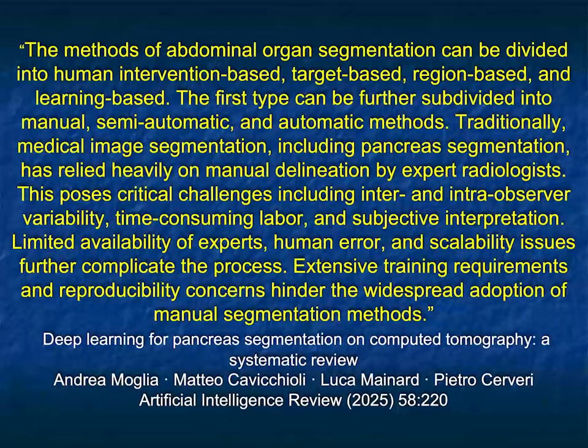People have done select cases with some reasonable results, but the question is, how do you do all the cases all of the time? Limited availability of experts, human error, and scalability issues further complicate the process. Extensive training requirements and reproducibility concerns hinder the widespread adoption of manual segmentation methods.